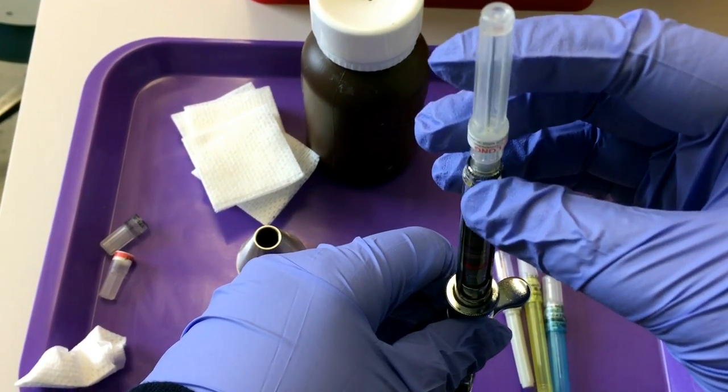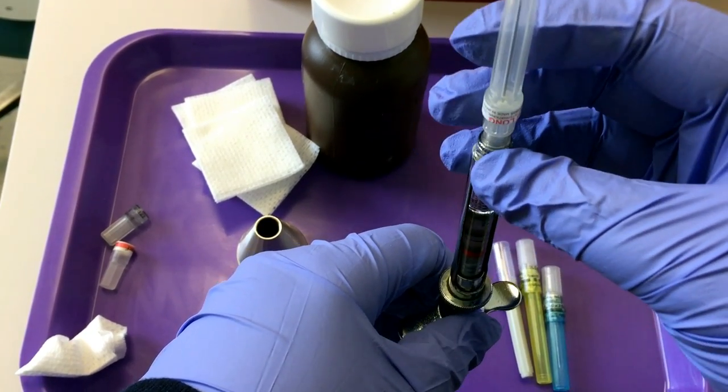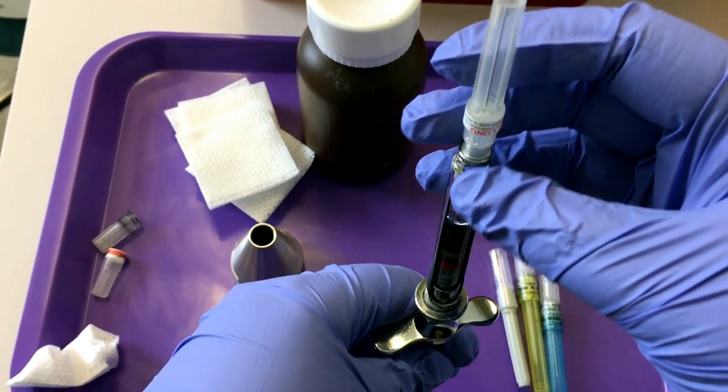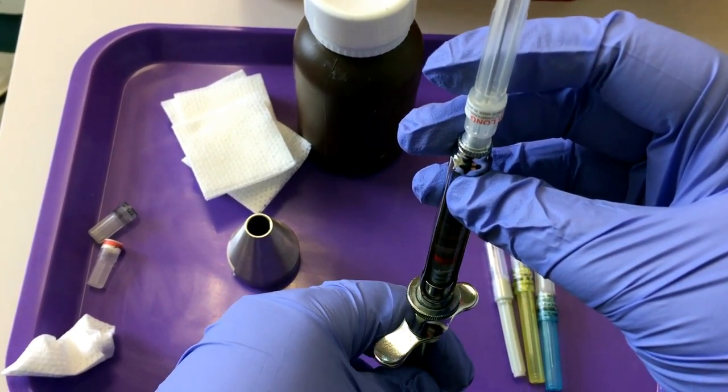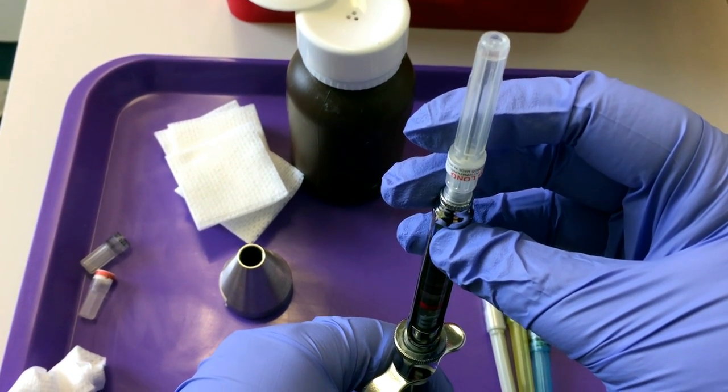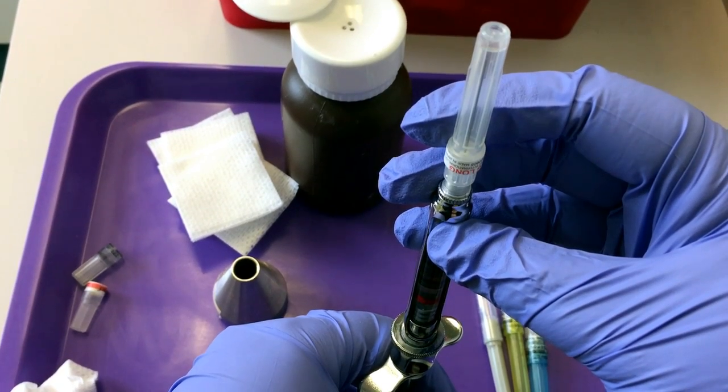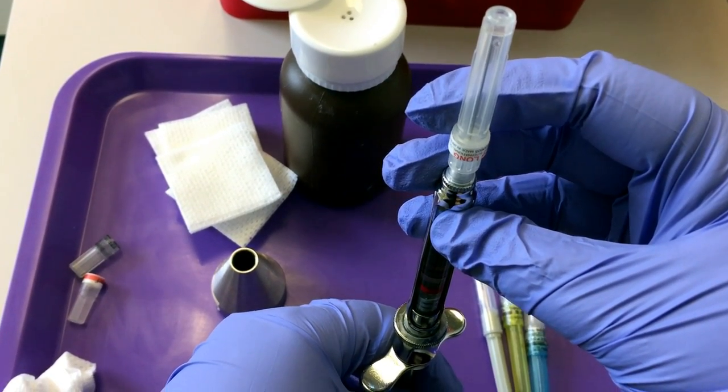Some needle caps are transparent or clear like this one. Others are not. If it's transparent or clear, you can gently push up on the thumb ring and watch until you have two drops of anesthetic come out.